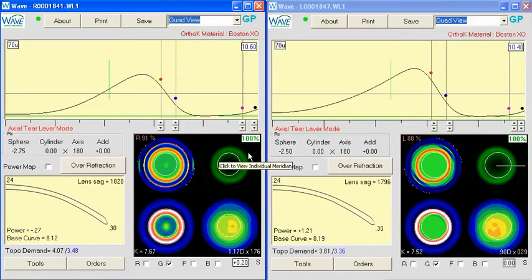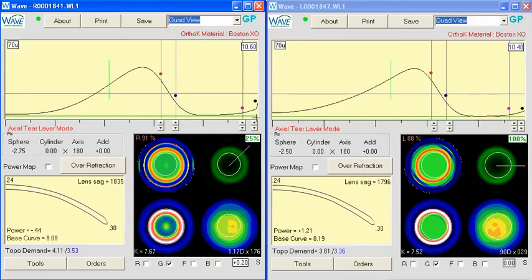At 0.27, I'm also going to go around, and oftentimes when we change demand or power, the individual meridians don't change uniformly. So 0.27 there and 0.6, we can probably make this a little bit more uniform. So I'm just going to change in 25% mode each of the meridians until we're pretty close.